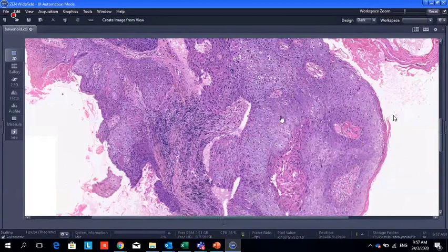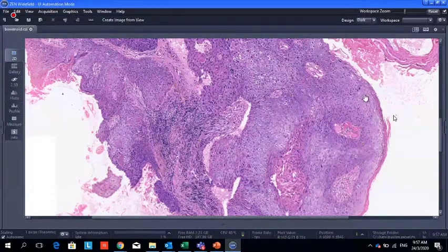Faham? So we can consider this as neoplastic as well, is it? Yeah, it's considered because it has started the changes in the epithelium. But if mild and moderate, it can be reversible. Oh, okay. In severe, I don't think it's reversible. It will progress to infiltrating cancer. All right. Thank you, doctor. Okay. Any question?